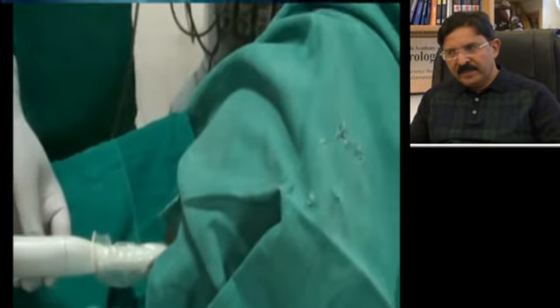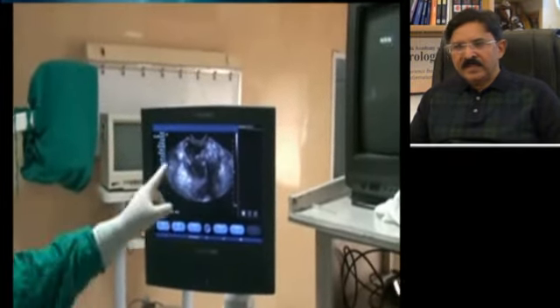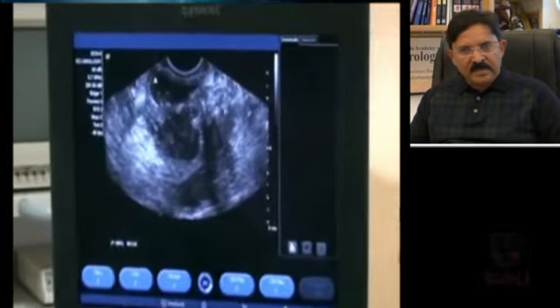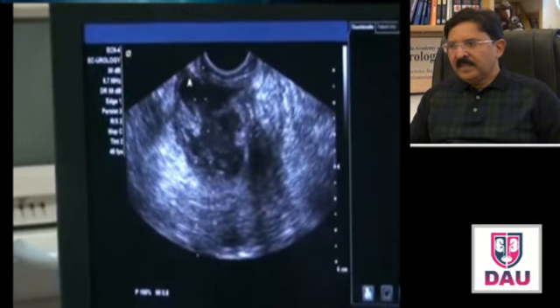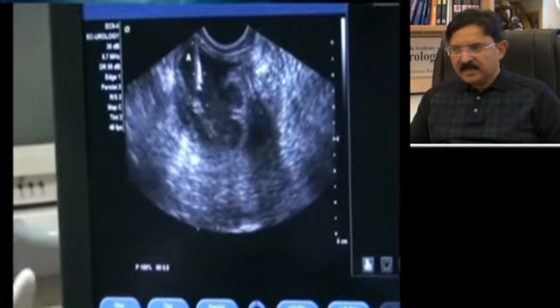The feeling of give way will tell you that you've gone into the cavity. You can monitor the abscess on transrectal ultrasound imaging. You can target the needle in this cavity and see the needle coming into the abscess cavity, like here.